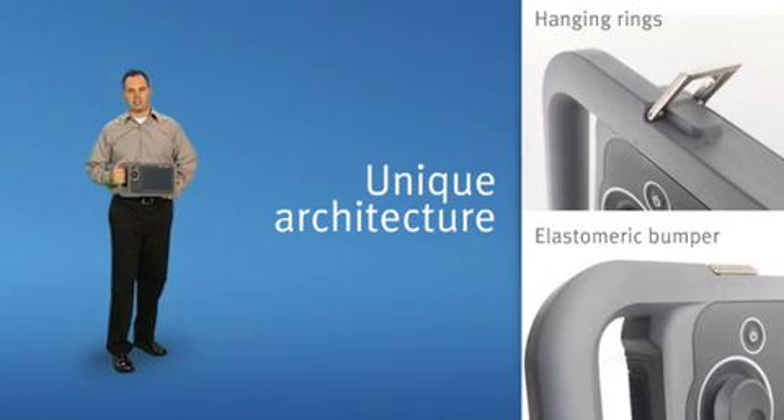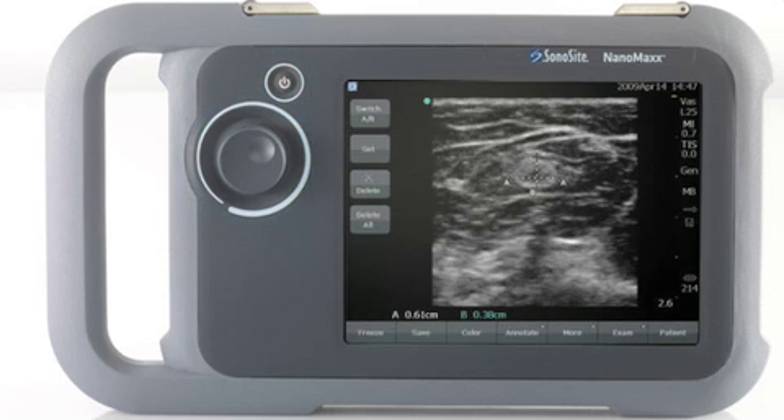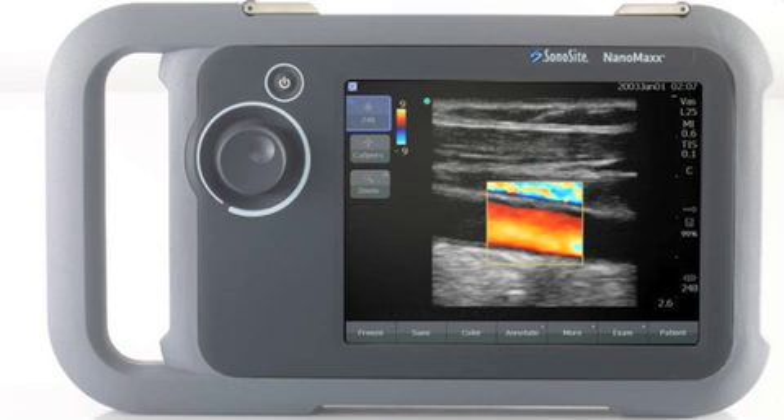The NanoMax is unique in its architecture with an external elastomeric bumper. NanoMax users will enjoy the simplified user interface with a power-on button and a programmable dial. Sonocyte's proprietary imaging algorithms will do the rest for you automatically.